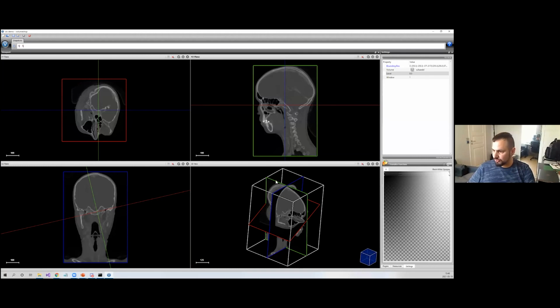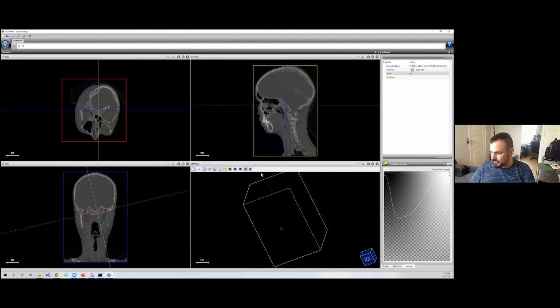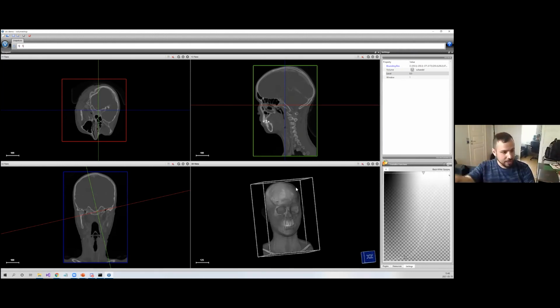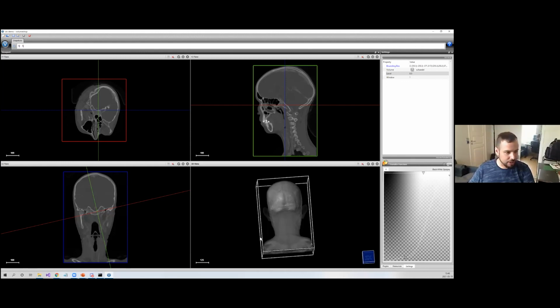So if we are looking at something like this, I can maybe switch to a volume rendering like this, and we can now maybe just specify a transfer function. So basically, here we now have an orthographic projection. So each of our pixels corresponds to one viewing ray that traverses the volume. And so then the direction for the maximum is specified by the rotation of the camera here.